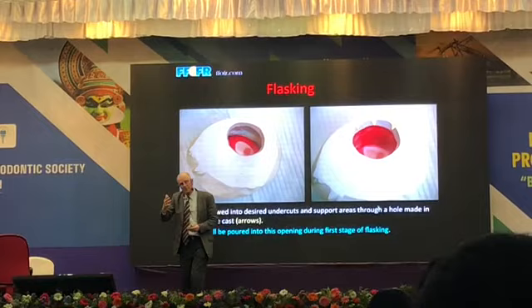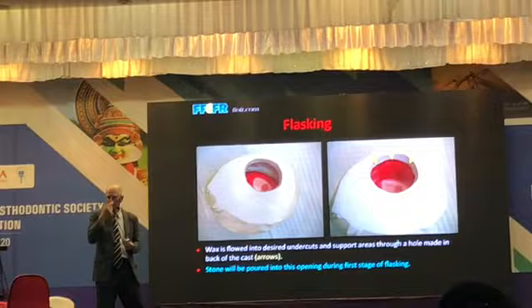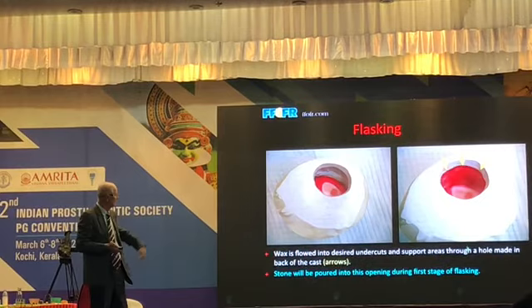And we want to extend the prosthesis onto the floor of the orbit because it helps keep it in position. Then what you do is you add a little adhesive to the top of the appliance and engage the floor of the orbit properly, and it'll stay in really well just with adhesive. You don't need implants on these kinds of small defects.